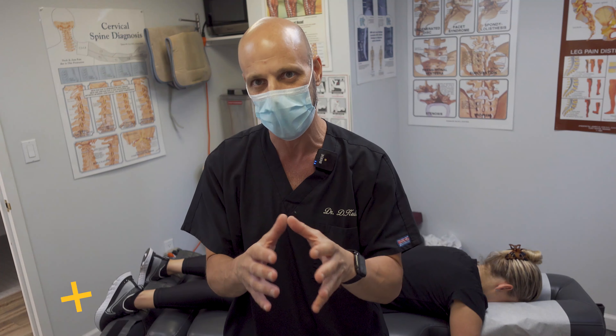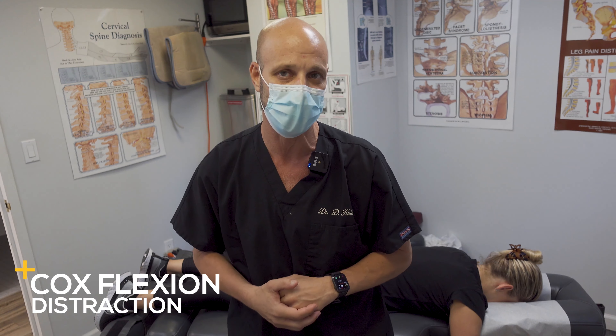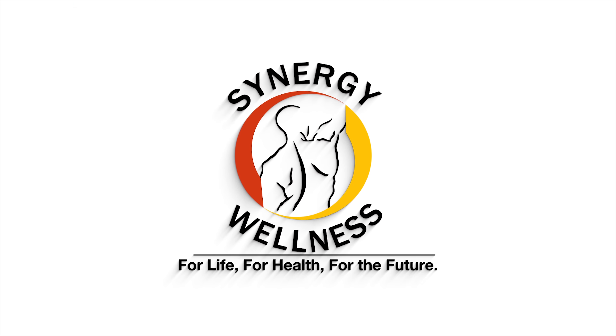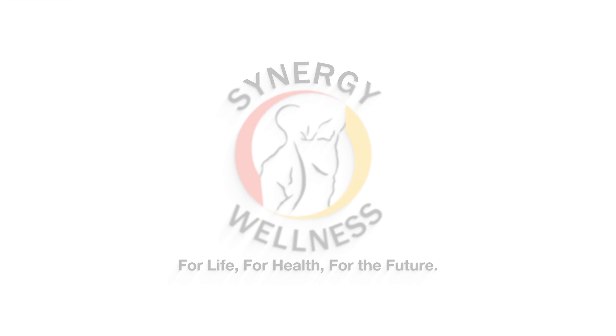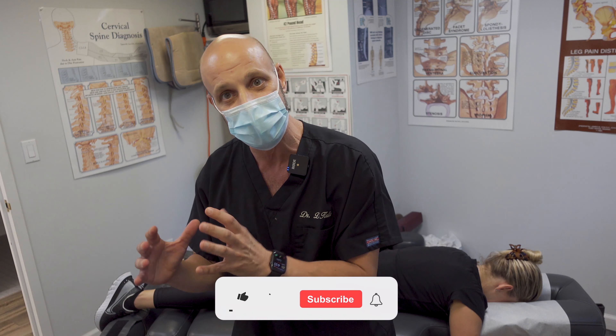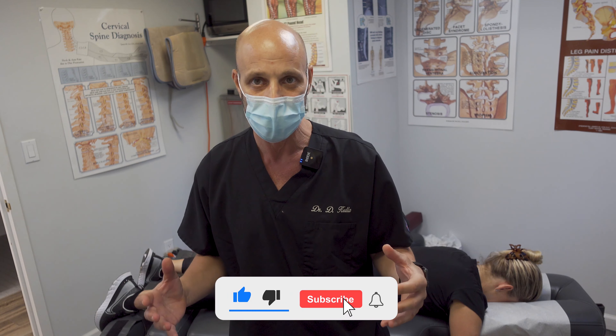Today we're going to show you how we do Cox flexion distraction and discuss what the technique is used for. Cox technique is part osteopathic and part chiropractic. Dr. Cox invented it — he's an osteopath — and his son is a chiropractor who evolved and vastly improved the technique. Dr. James Cox the chiropractor is now in his 80s and he is an incredible chiropractor.